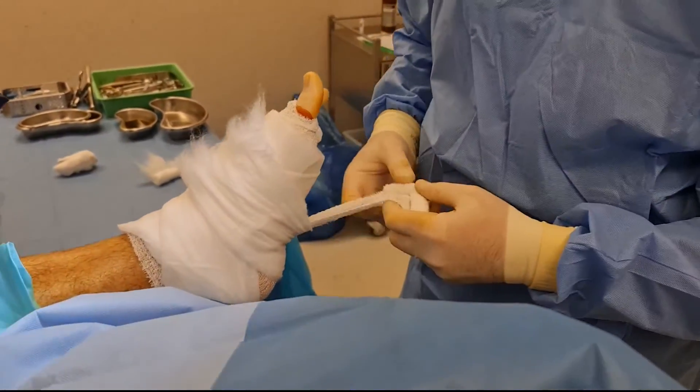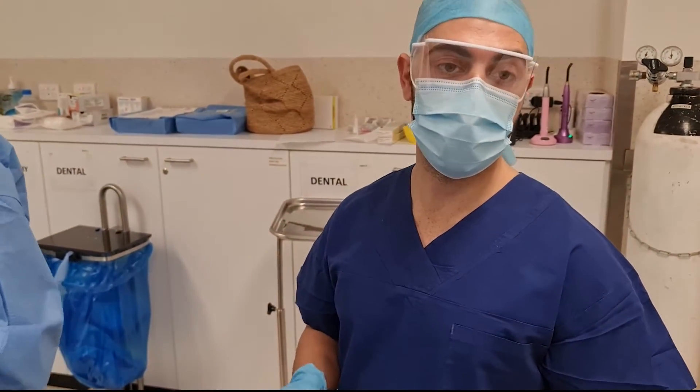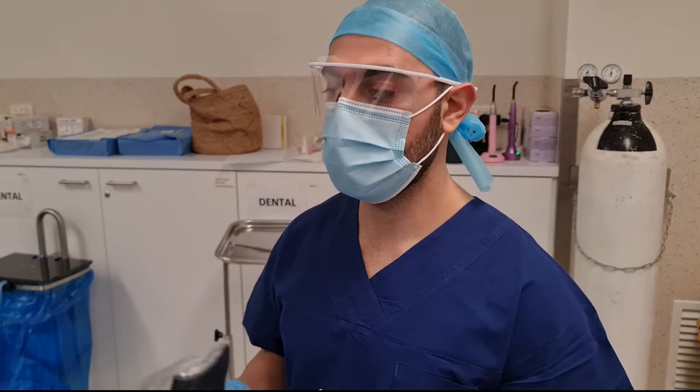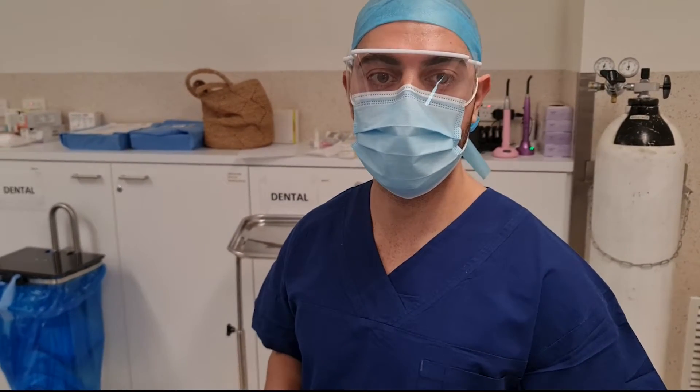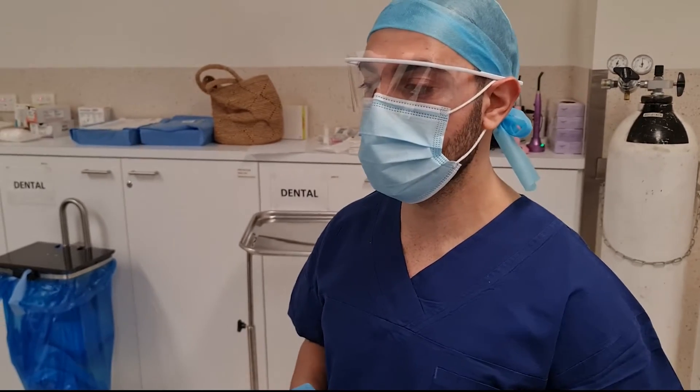Which company sells this, Charles? This is from LNT Surgical — we currently have this device in. It's available Australia-wide and has just come in a few weeks ago, already getting some good success. We're showing it to surgeons, anaesthetists, and also allied health students to get them involved.